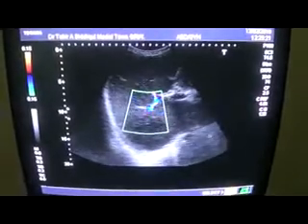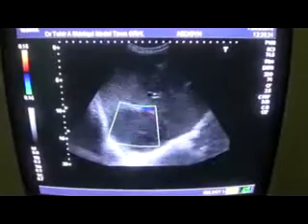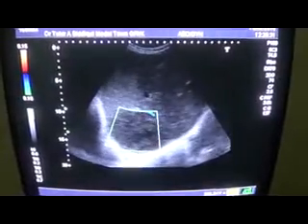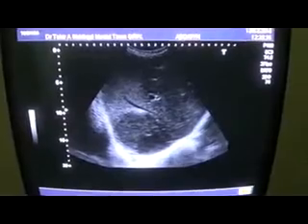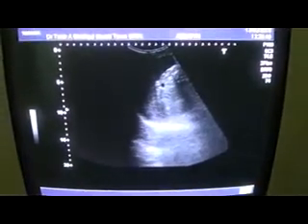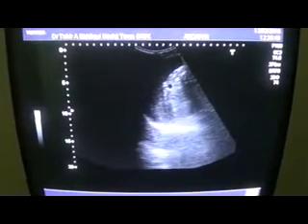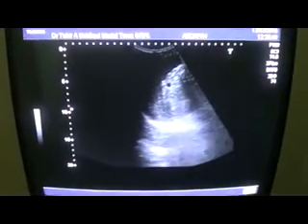The liver is normal. Here comes the portal vein. The gallbladder is normal. One thing I would like to see, now this is the liver abscess, this area. Now one thing that I will see is if there is any splenomegaly. No, the spleen is normal. So this is a case of the day that relates to a bowel-related pathology in the right lower quadrant with a healing phase liver abscess. Thank you very much.